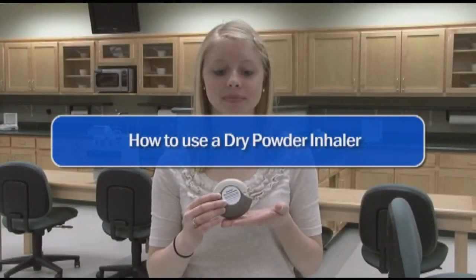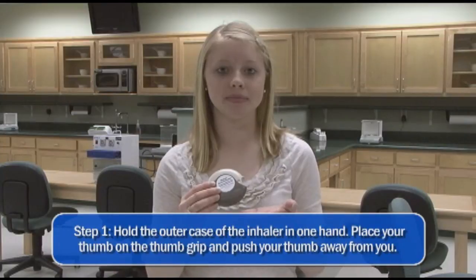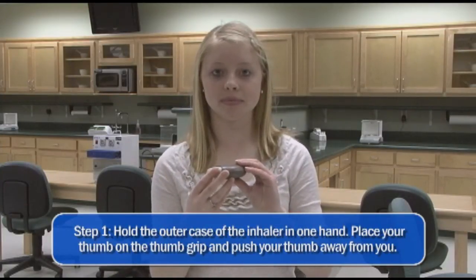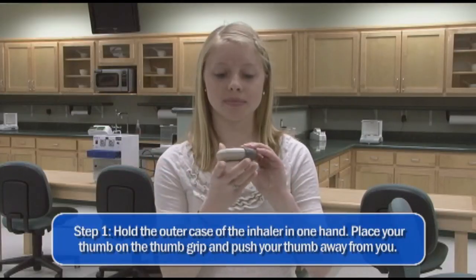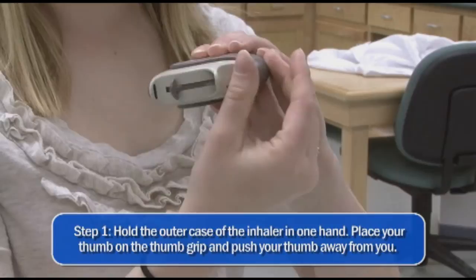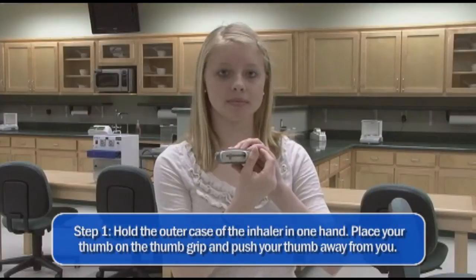This is a dry powder inhaler discus. First, you need to hold the outer case of the inhaler in one hand. Next, place the thumb of your opposite hand on the thumb grip. Then push your thumb as far away from you as possible. You have now opened the discus and the lever is now exposed.